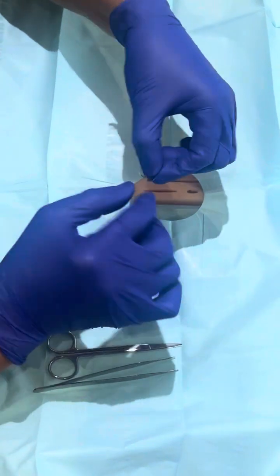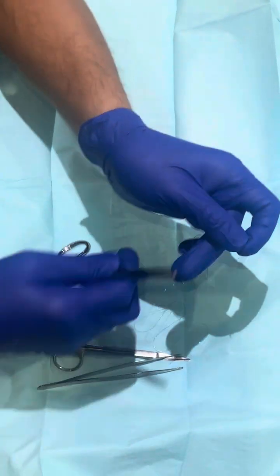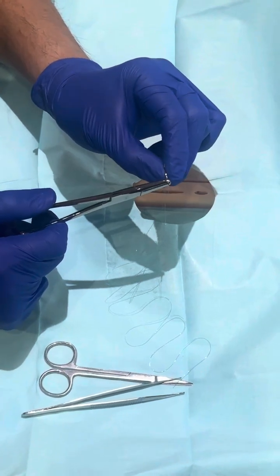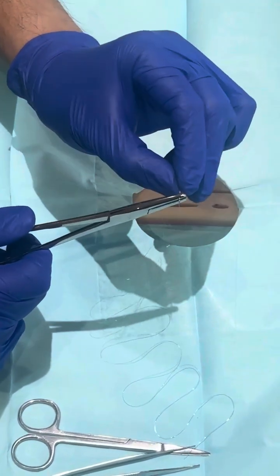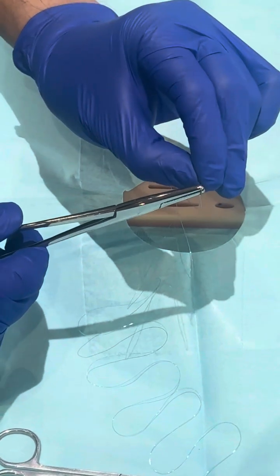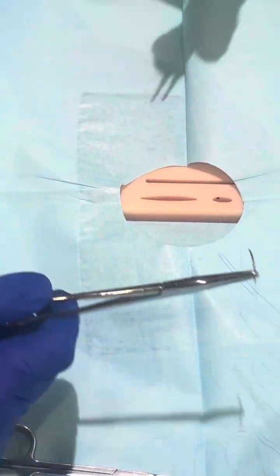Grab the end of the needle and then get your needle driver, biting it to the 1/3 of the suture, the other third, and then using your forceps.